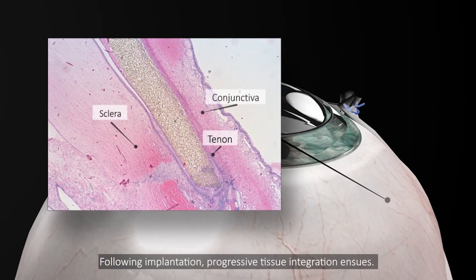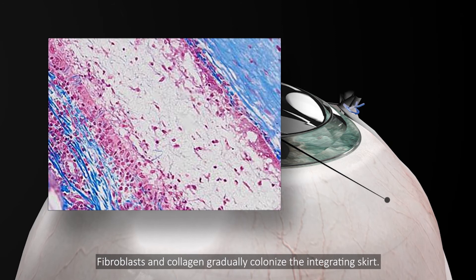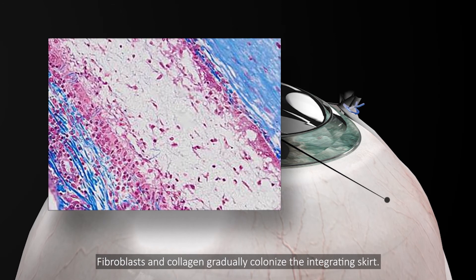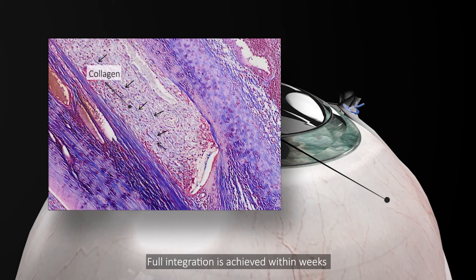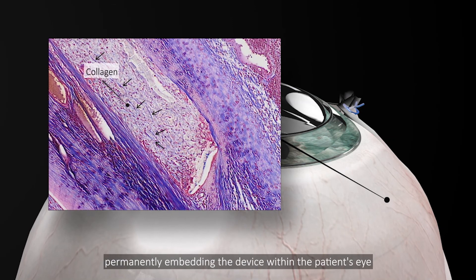Following implantation, progressive tissue integration ensues. Fibroblasts and collagen gradually colonize the integrating skirt. Full integration is achieved within weeks, permanently embedding the device within the patient's eye.